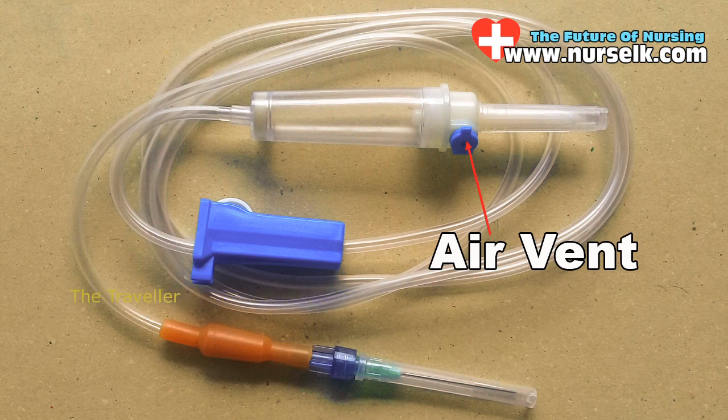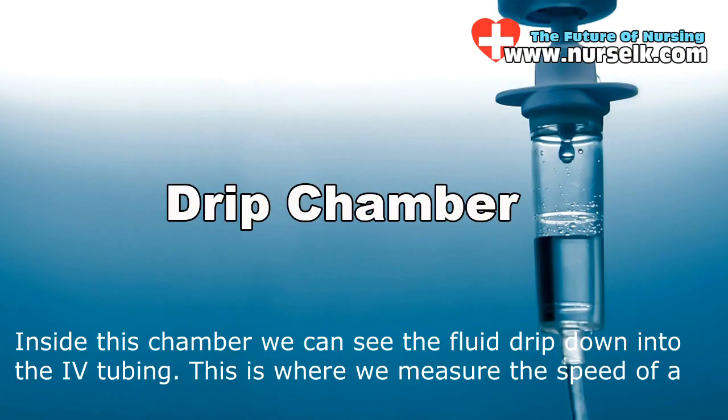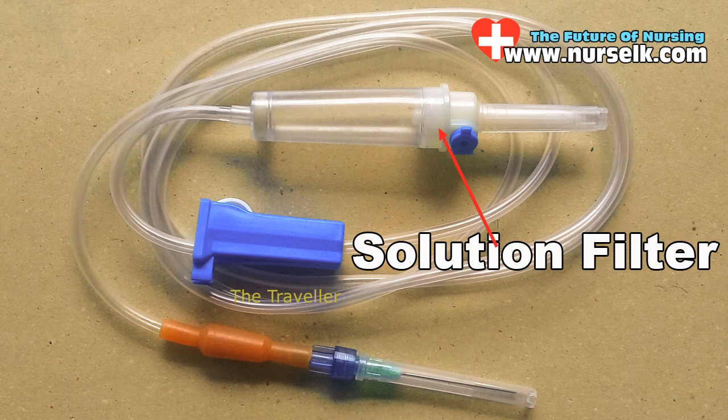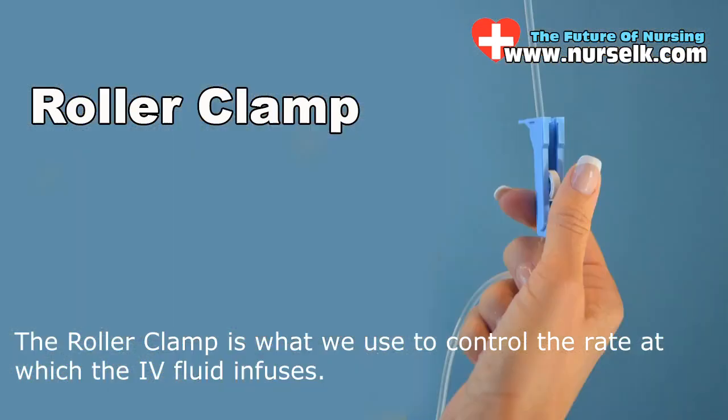This is the drip chamber. Inside this chamber we can see the fluid drip down into the IV tubing. This is where we measure the speed of a manual IV setup — we look at this chamber and count the number of drops per minute. Next is the solution filter, then the roller clamp, which is what we use to control the rate at which the IV fluid infuses.